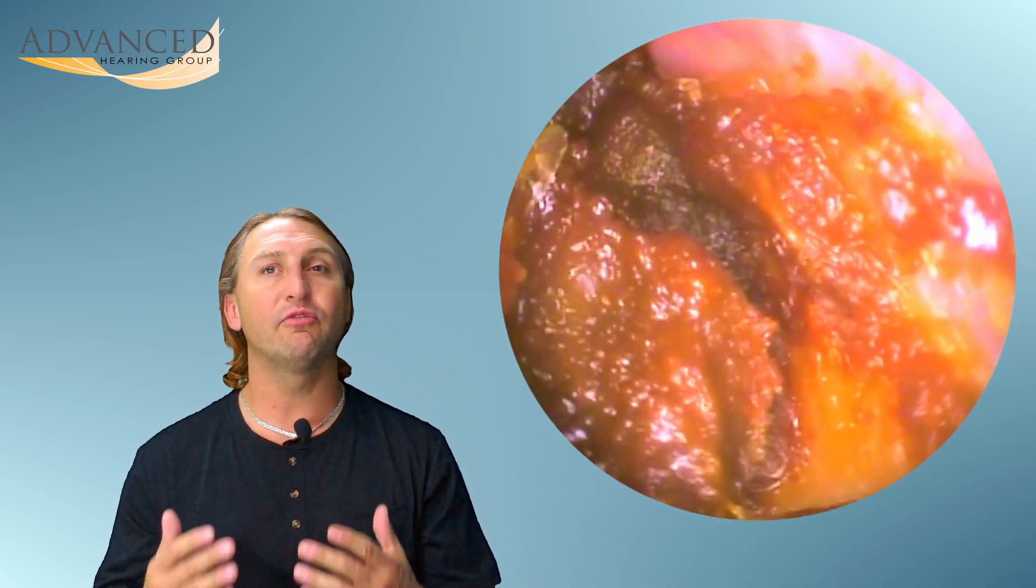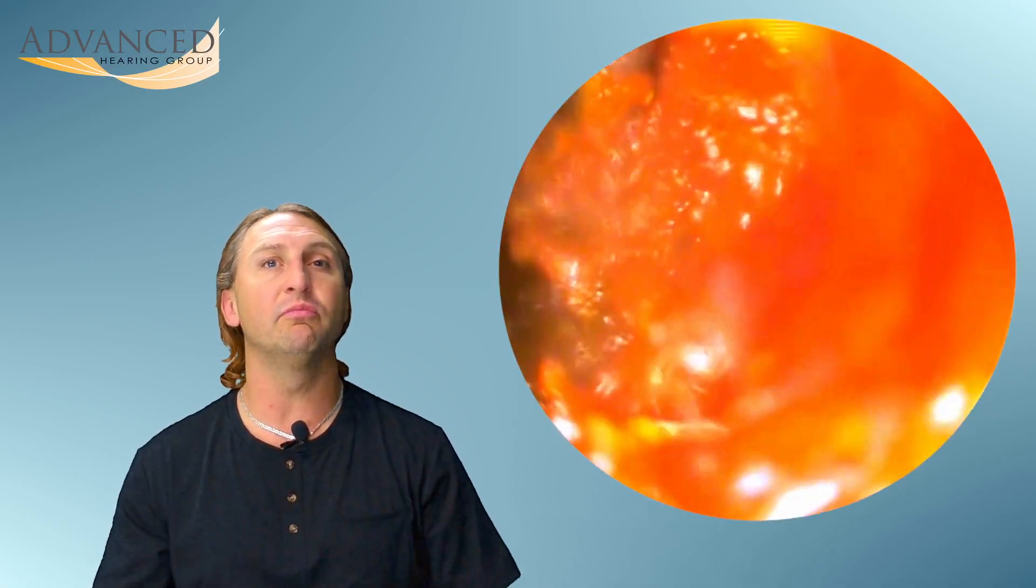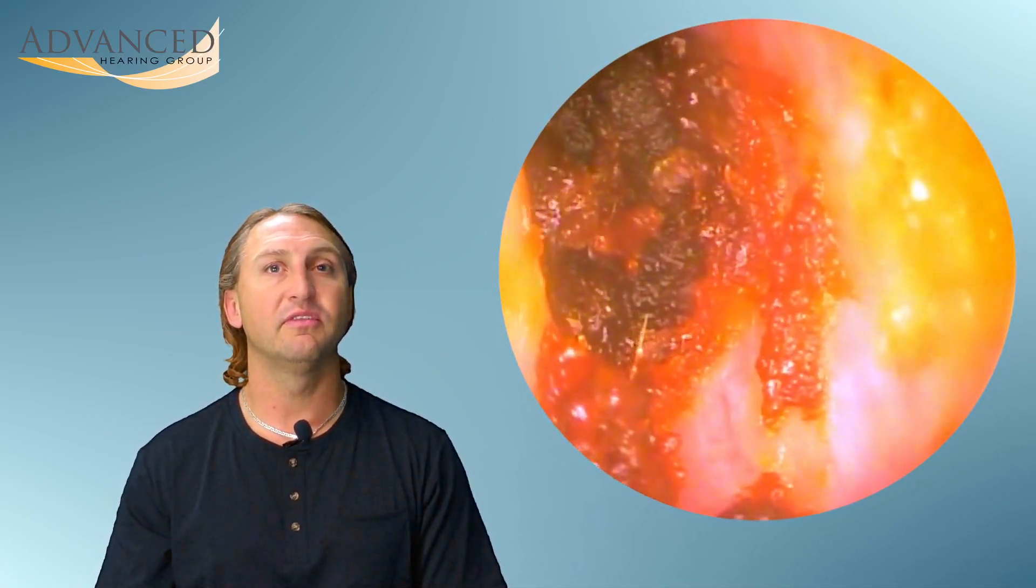Let's take this first patient here for example. They tried every at-home remedy you could think of. They started by using Q-tips, when that didn't work they switched to the corkscrew looking tool that says you can safely remove earwax at home. It didn't do any real damage to the ear canal. We do see a little bit of redness down there but no major damage, and yet the wax is still in place.